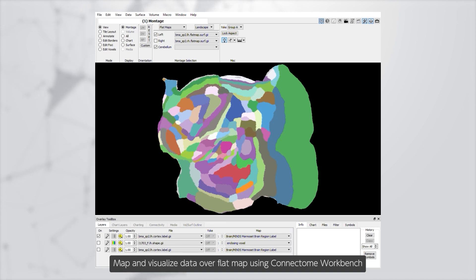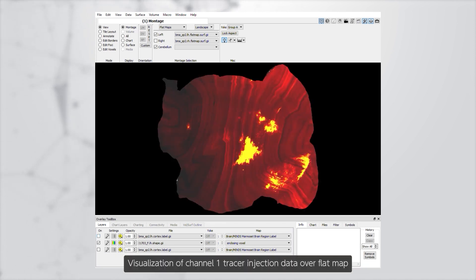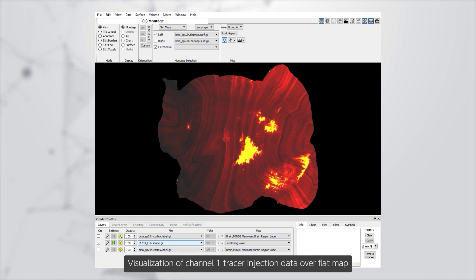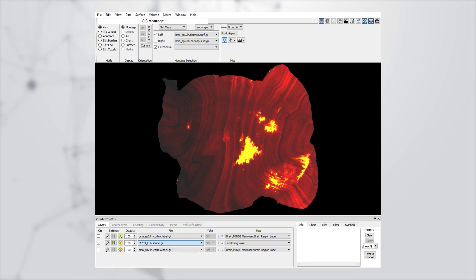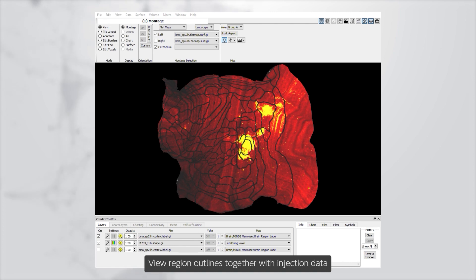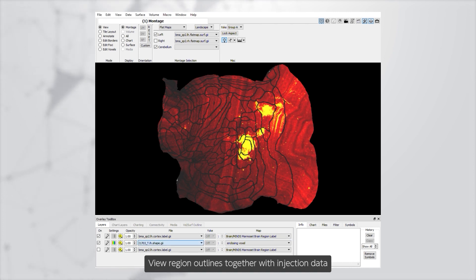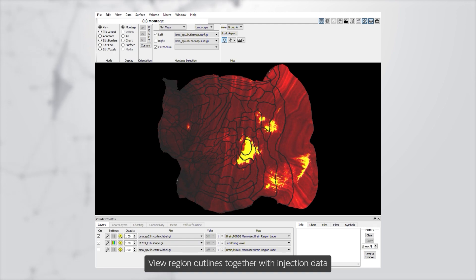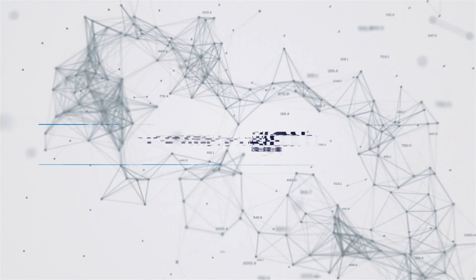Map and visualize data over the flat map using Connectome Workbench. This includes visualization of Channel 1 tracer injection data over the flat map, visualization of Channel 2 tracer injection data over the flat map, and viewing region outlines together with injection data.